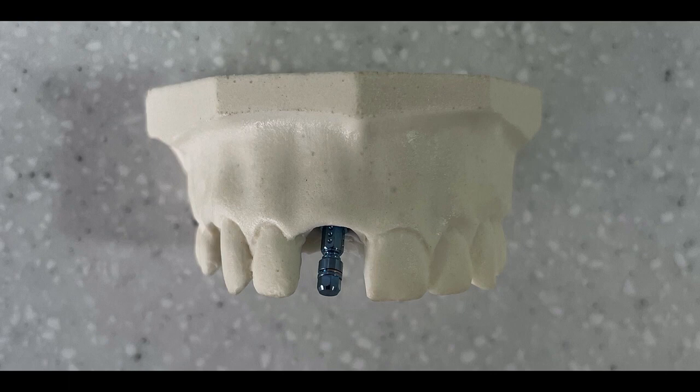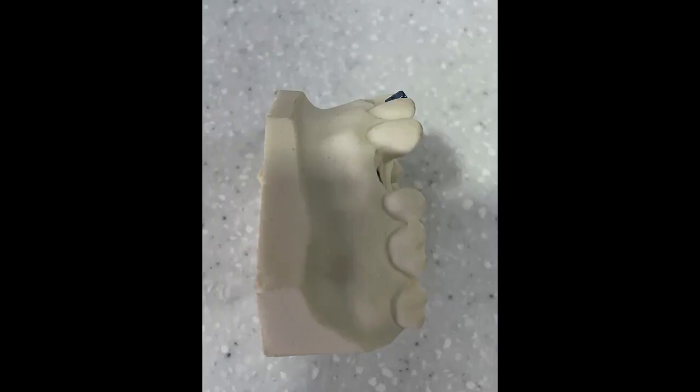And if we were to try and restore this with a scan body and a scan post and a tie base, we just would not get the result that we want. And this is why we have to think of alternative solutions. And there's a variety of solutions that are available to us on the market. And again, the topic of this talk is going to be the Atlantis abutment in the workflow. And you can see here quite clearly that the emergence of this implant is way too labial.